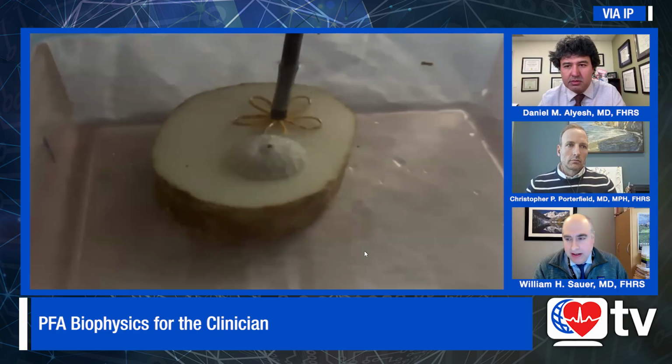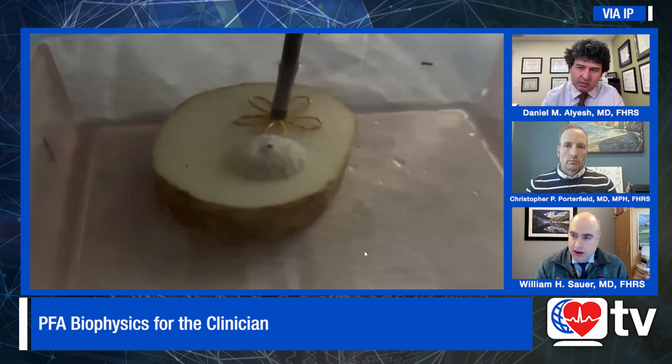I think an endothelialized left atrial appendage occlusion device is safe to ablate near. I would say you want to avoid touching metal when you're delivering energy, just because it's able to conduct and it could have unpredictable effects. I think that's the lesson here, and more and more we encounter these things. But it's similar to RF ablation, where we also have to be careful with metallic exposure near RF electrodes. So just building on that.